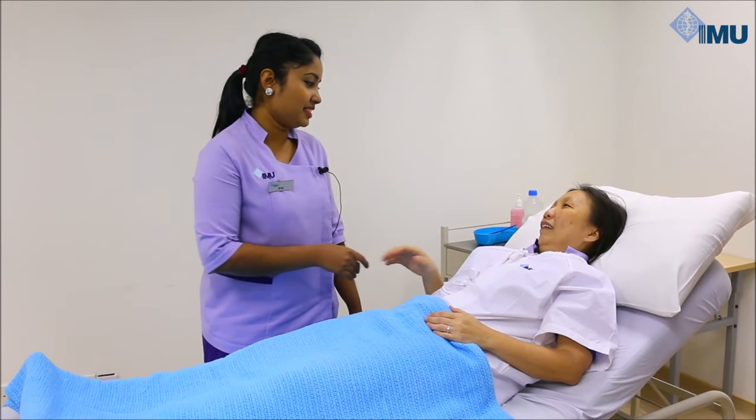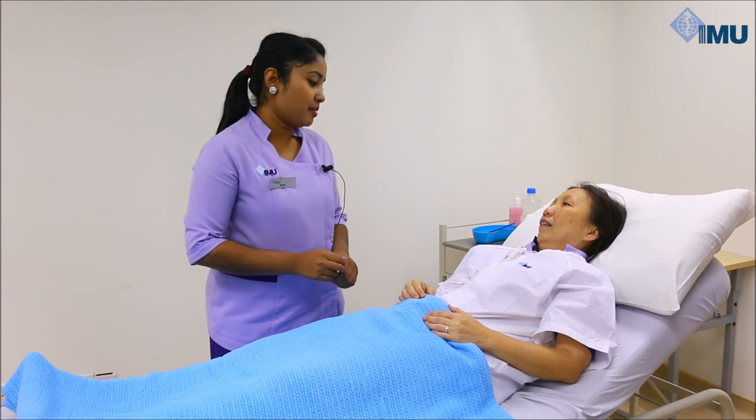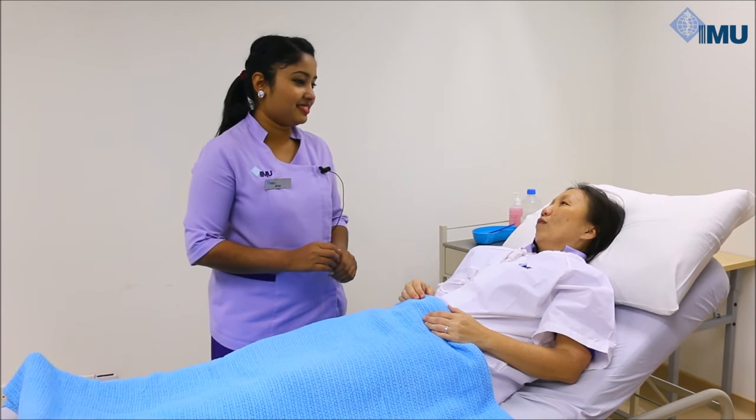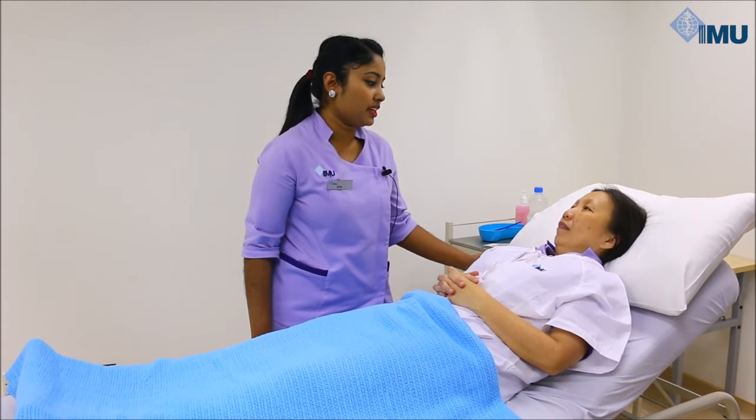Hi, good morning. I'm Nithya Ramasamy. I'm a second-year medical student from IMU. May I have your full name, please? Jane Chong. You can call me Jane. Okay. Mrs. Jane, I understand that you're hospitalized for a surgery.